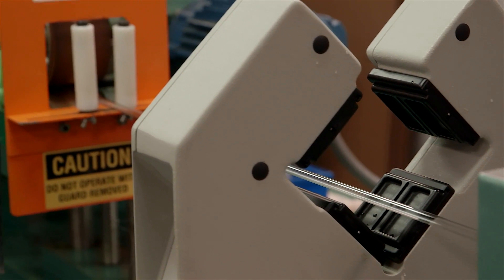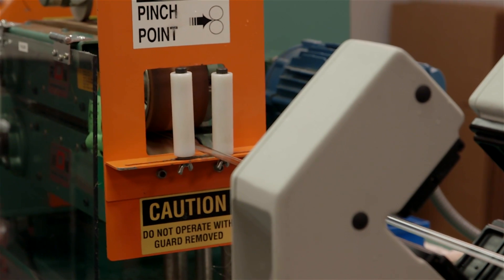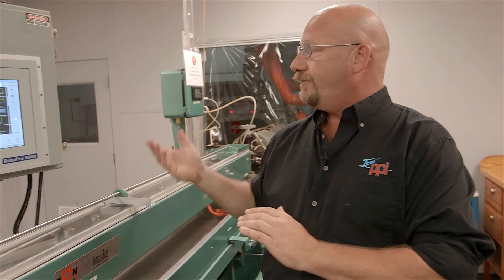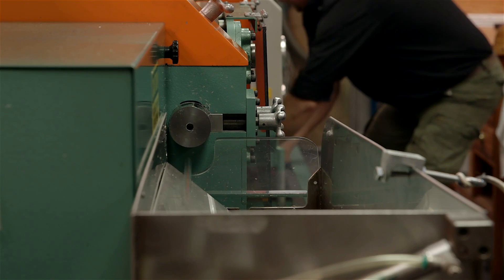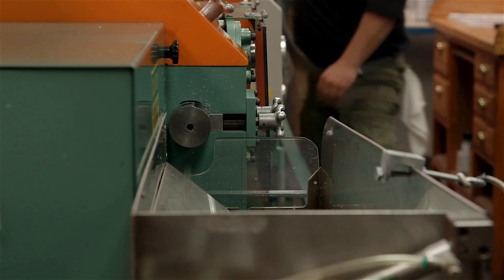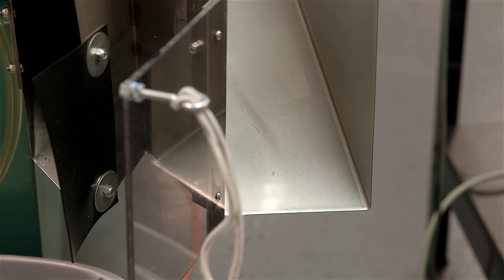We have actually been able to set up tight tolerances to ensure a quality product to our customer. If we should happen to fall out and reject, a rejection will come up, it will open a trap door. Now we're conveying that bad product over into a scrap bin.